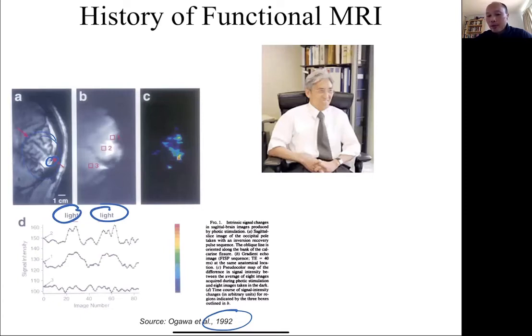During surgery, you can basically see the vessel anyways if you open up, so it's probably less frequently used in that capacity. But there are interventional setups where they might have a surgical bed where they take the subject over to the surgery, and then they have a rail and they slide them over and put them in an MRI scanner and move them back and forth. And that has been used. The problem with using MRI during surgery is that the form factor makes it a little more difficult, especially if you have this big tube.